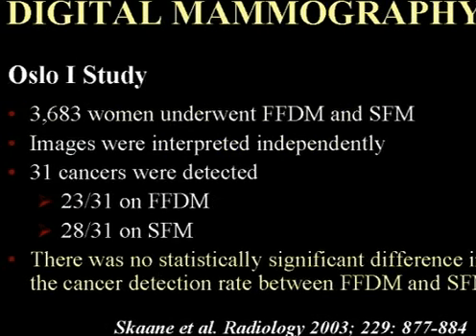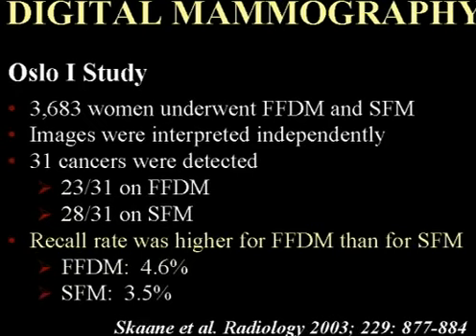Now, in Scandinavia, they attempted to duplicate these studies from Lewin and Dorsey. Well, they got about 4,000 women who again underwent both imaging modalities, and they found the same thing: no statistically significant difference in cancer detection between screen film and digital. Their recall rate was slightly higher on the digital modality, but again, look at how low the recall rates were in Scandinavia, somewhere on the order of 3 to 4%.